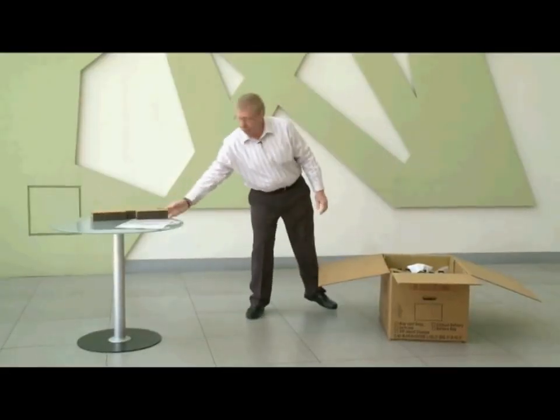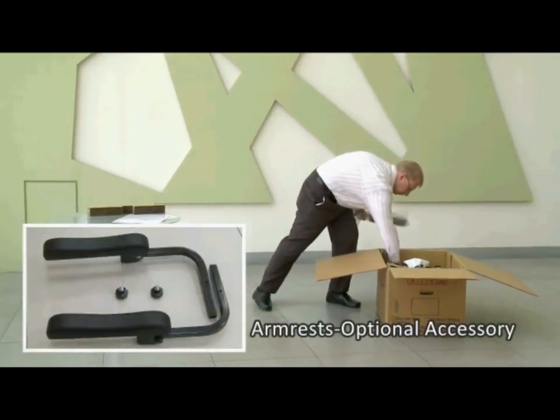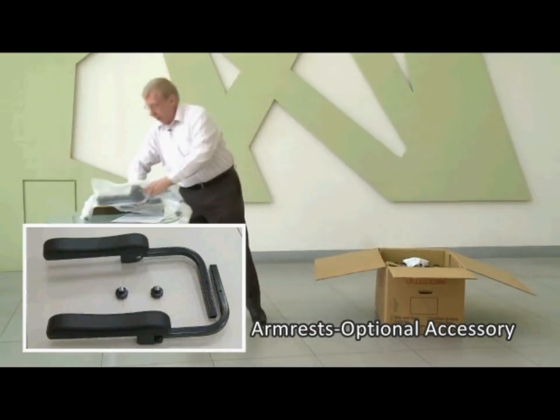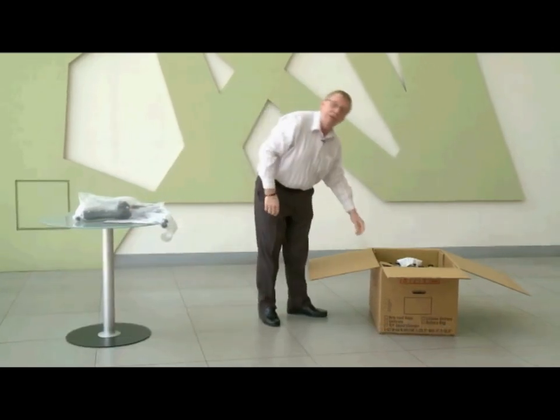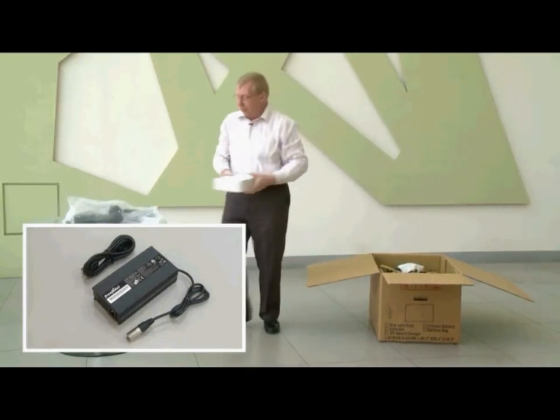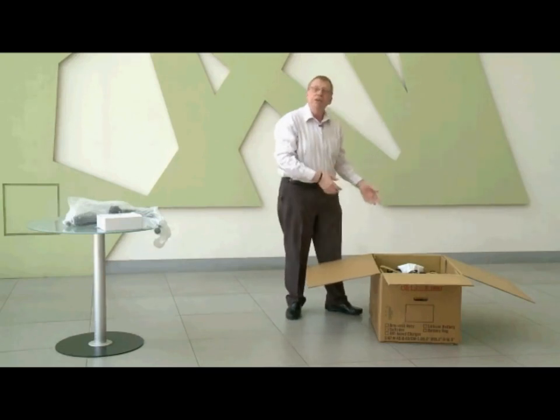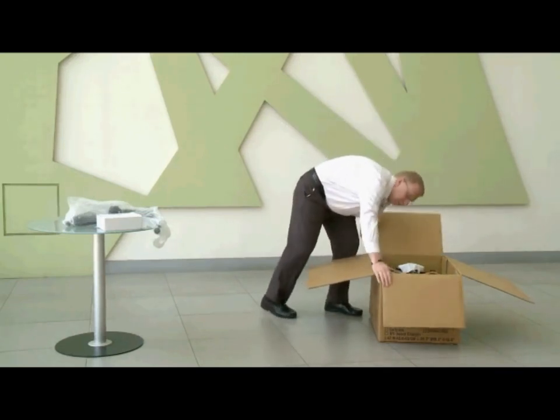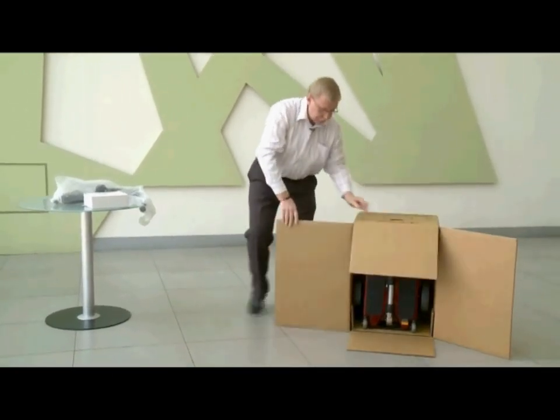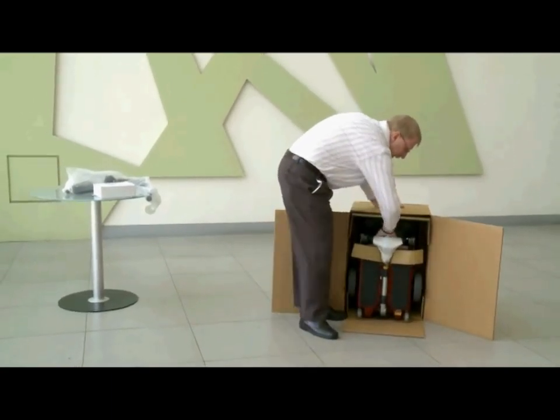Take out the cardboard that comes with the packing and the armrests. The next thing you need to do is take out the charger — very important. Now you're ready to take the scooter out of the box. Simply lift it up on its side like this. Grab hold of the handle and just slide it out.